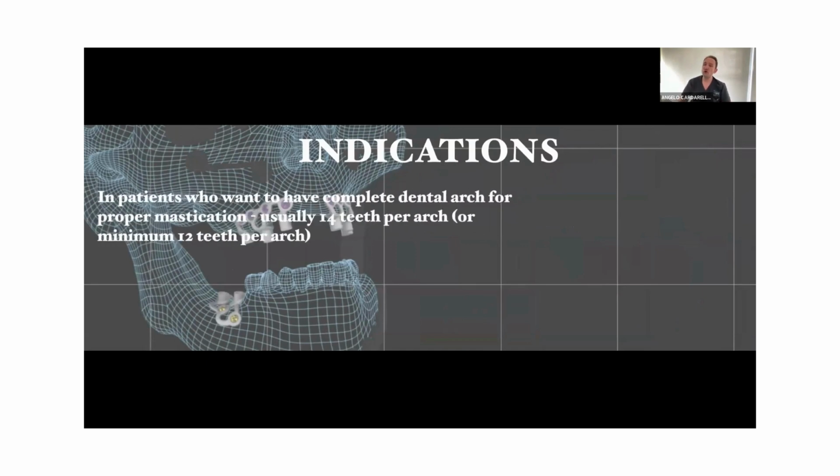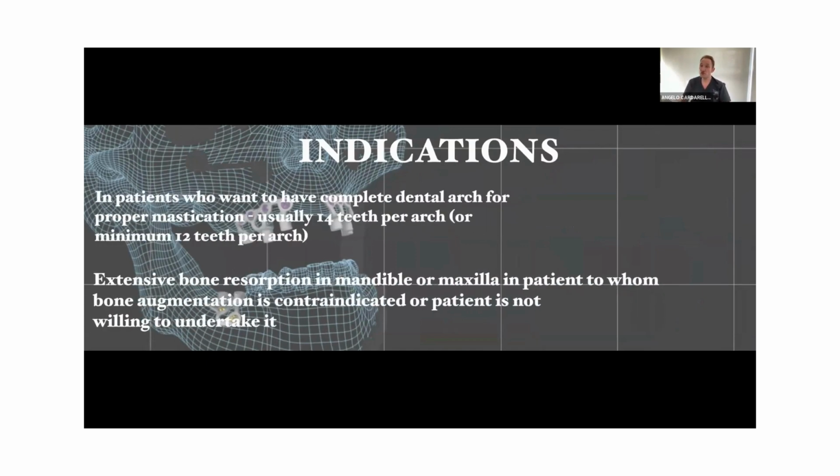And as I told before, which are the indications? For sure, in my practice, for example, I'm using the customized implants in old patients, in patients with some systemic disease, in which it's impossible for many reasons to make bone regeneration, for example. Or actually, instead in the maxilla to use the zygomatic, I prefer to use customized. Why? Because if I have some complication with the customized implant, it's easier to solve, it's easier to manage.